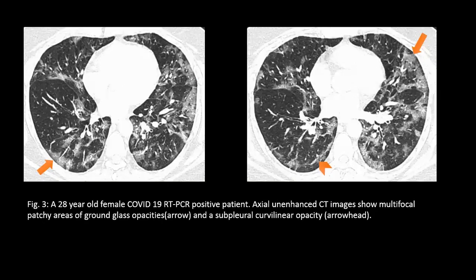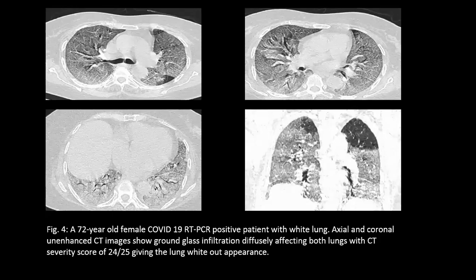In this axial unenhanced CT, we can see multifocal patches of ground glass opacity as shown by the arrows, and subpleural curvilinear lines shown by the arrowheads. This coronal unenhanced CT image shows diffuse ground glass opacity of both lungs with a CT severity score of 24 out of 25.